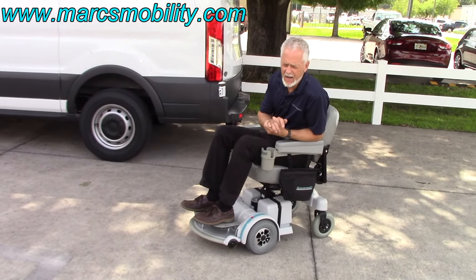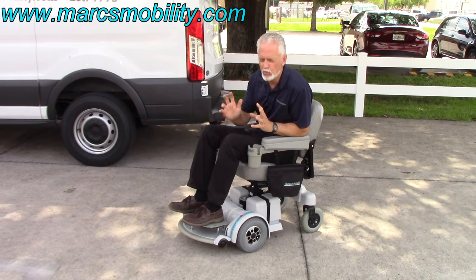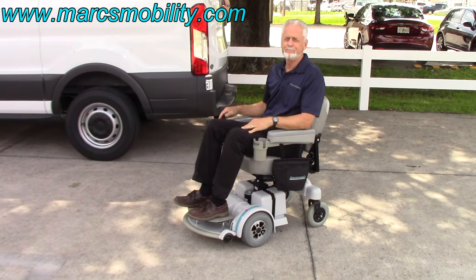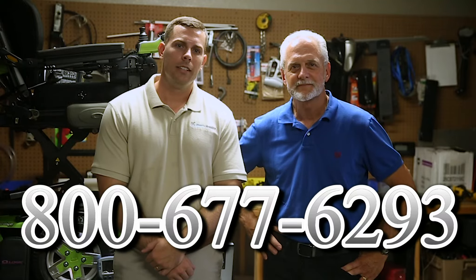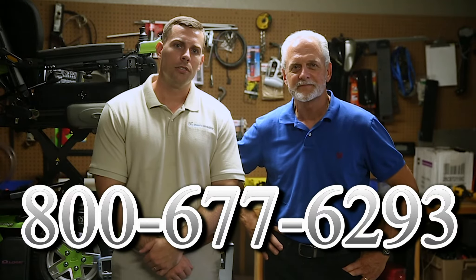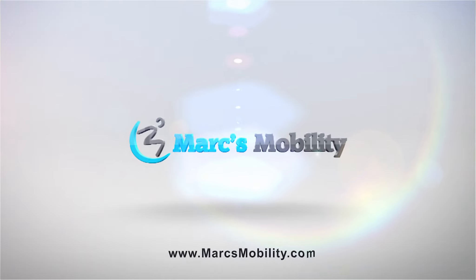This is the Hover-Round MPV-5 with the seat lift. The motors are a little bit noisier than most because they're high-torque motors. New condition with a 5-inch seat lift, no problem in the grass — all kinds of power, ready to go. We are a family-owned business for over 25 years. We have many products available, not just what you see in this video. You can call us at 800-677-6293, or visit us at www.marksmobility.com.